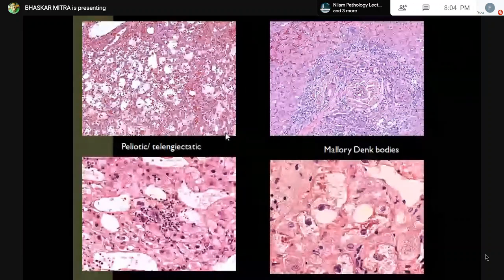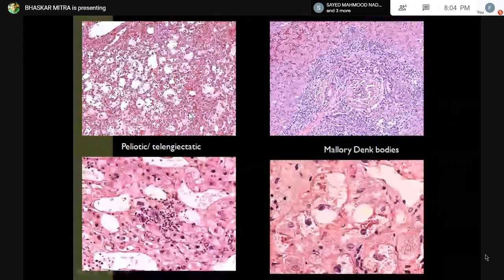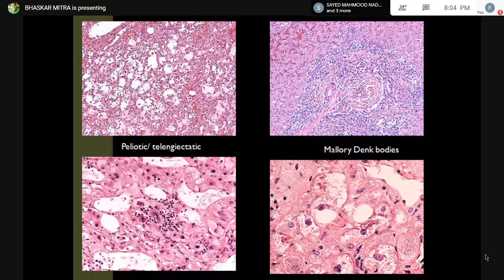Here I will first explain what the term peliotic suggests. Peliotic means there are ill-formed vascular spaces that are not lined by sinusoids. Hepatocytes are there. There is proliferation of blood vessels containing RBCs, and it looks like telangiectatic vascular spaces throughout the lesion. There is increased inflammation. There may be small bile ductular-like areas surrounded by dense inflammatory lymphocytic infiltrate that can be seen here.